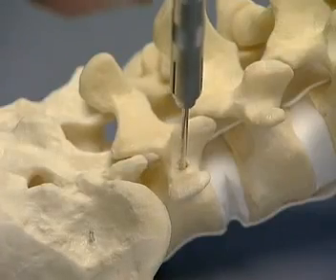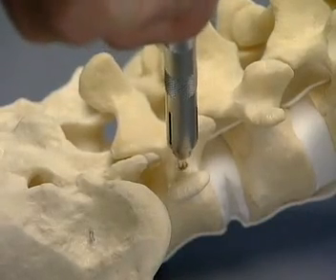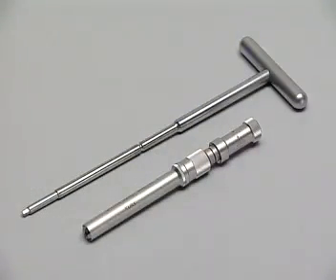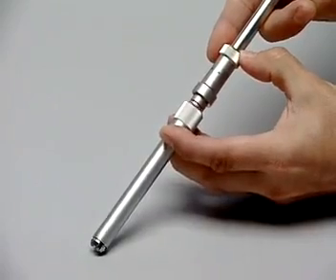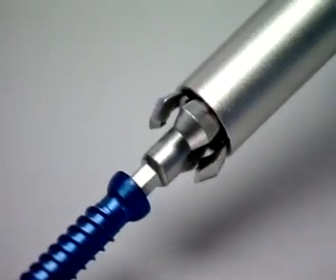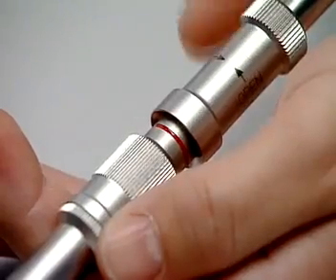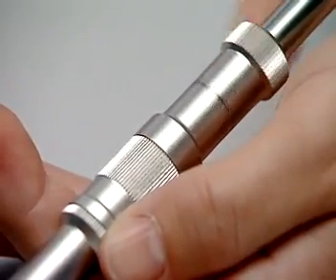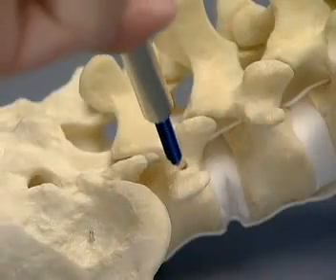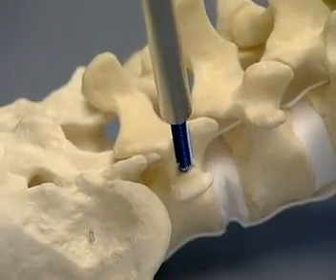The length of the pedicle screw needed is measured, ensuring at the same time that bone surrounds the pedicle hole. A screw of the appropriate length is inserted using the T-handled hexagonal screwdriver and the holding sleeve. The screw is locked in place, but not fully inserted, leaving a few millimeters between the screw head and the bone. The holding sleeve is then released.